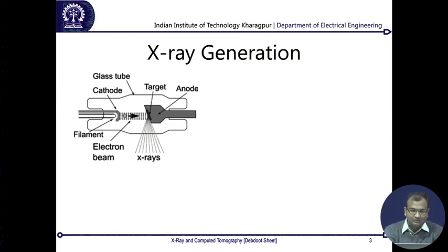Now, as these go and move towards the anode, which is the positively charged surface, they strike this anode. As they strike it, it emits X-rays, and generally these X-rays come out in a path which is different from the path in which the electrons are coming. And to make it even simpler, I want an exit path coming out over there, because I want to focus at some different part of the body. So, there is basically a 45-degree inclination angle over there.